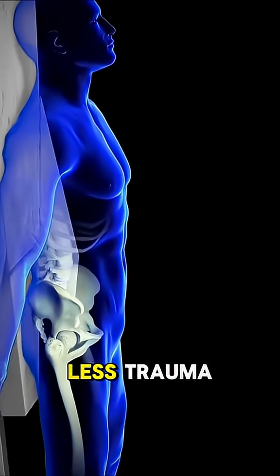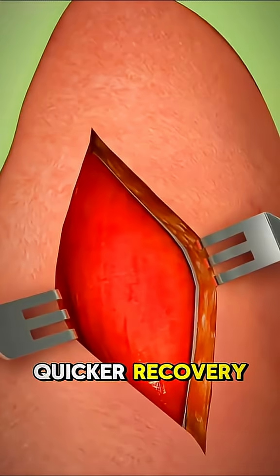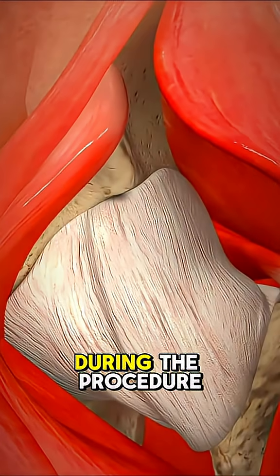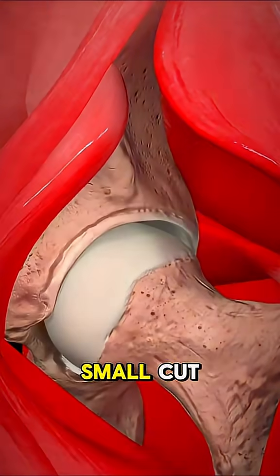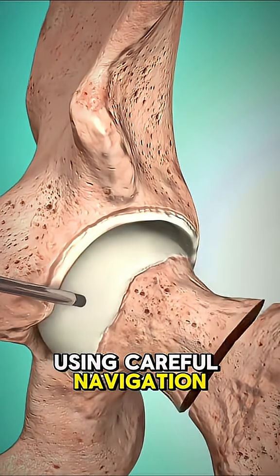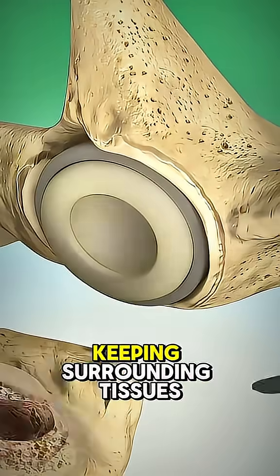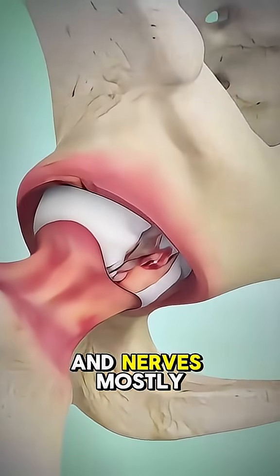That means there's less trauma, which often leads to a smoother, quicker recovery. During the procedure, doctors make a small cut near the front of your upper thigh. Using careful navigation, they gently move muscles aside rather than cutting them, keeping surrounding tissues and nerves mostly intact.